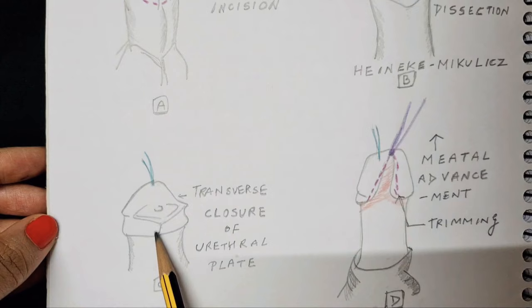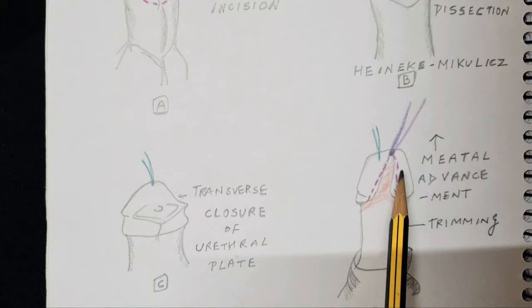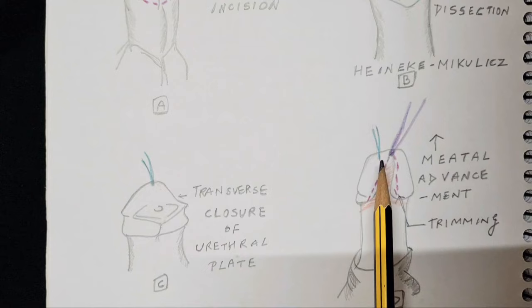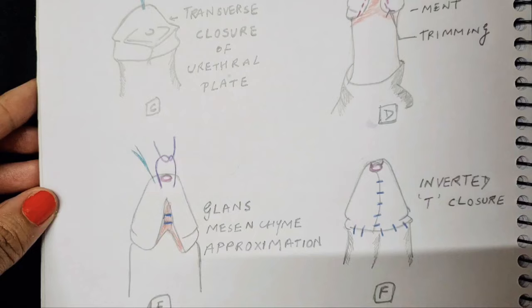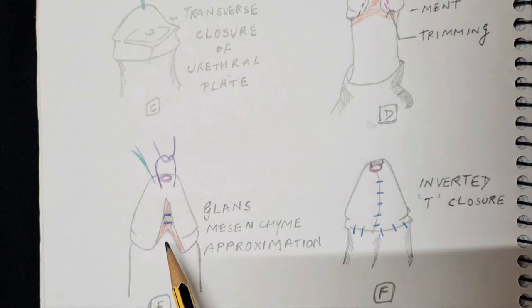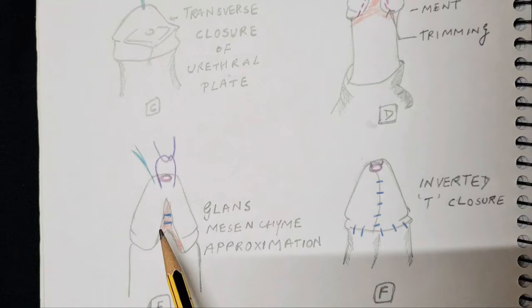Once this advancement has been done, a stay suture is taken at the ventral-most tip of the new urethral opening, and the glans below it is dissected. The glans wings formed here are trimmed on the edges and excess tissue is removed so that the glans mesenchyme below, which has to be approximated, is visible. This forms the glansplasty component.